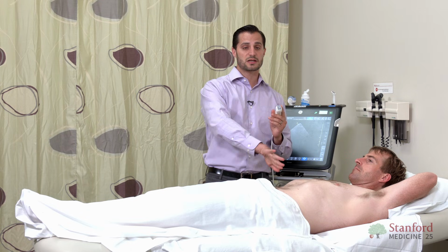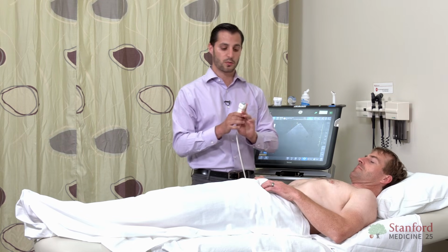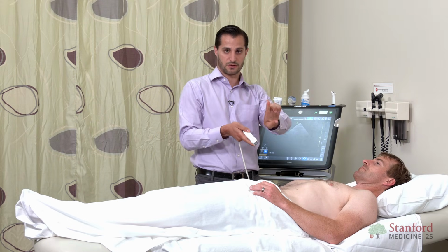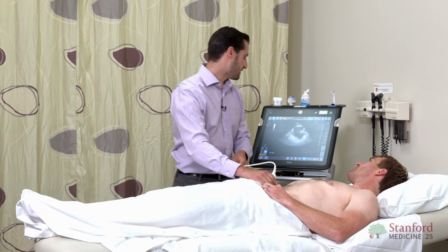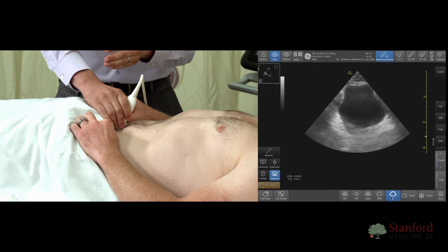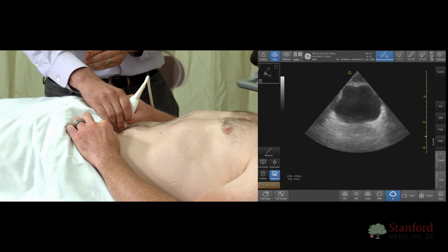First, let's just discuss scanning of the bladder. You're going to be quite low in the abdominal cavity, well below the navel. When I think about my orientation marker, my marker to start is pointed in a 3 o'clock position. In most patients who have some fluid in their bladder, it's generally quite easy to visualize. My probe itself, the head is pointed more towards the pelvis as I'm scanning. Here we can see the patient's bladder.